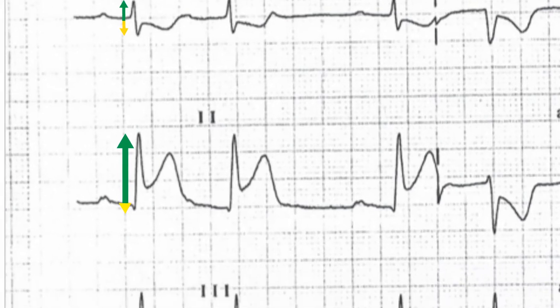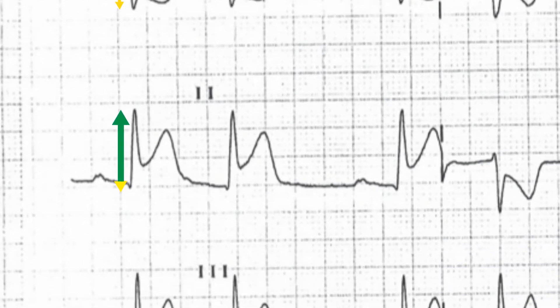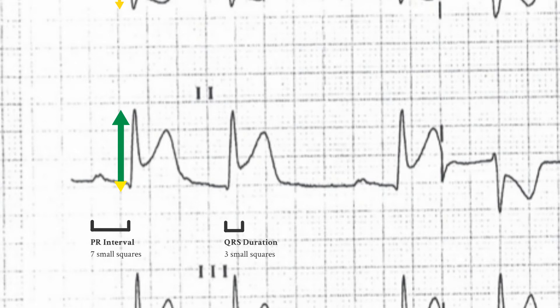The PR interval measures 7 small squares and is therefore prolonged. The QRS complexes are 3 small squares in duration and are therefore normal.